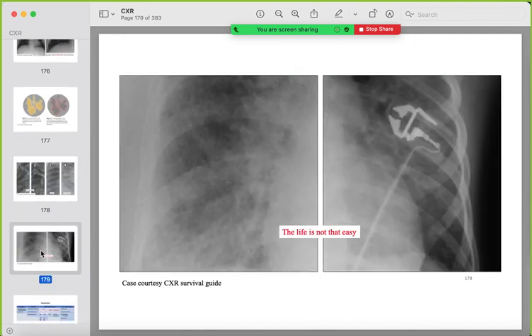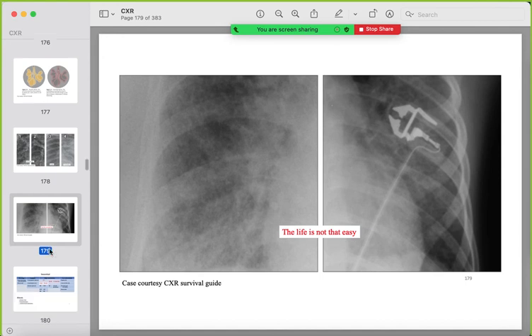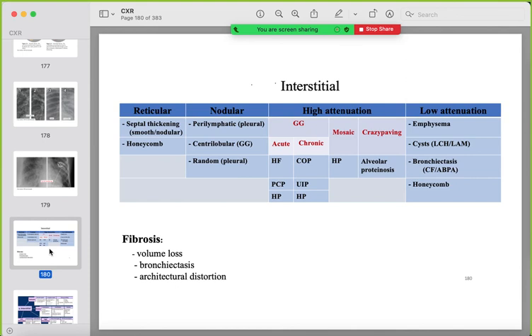Sometimes alveolar and interstitial changes coexist in the same image. On HRCT, interstitial lung disease patterns include reticular (septal thickening, honeycombing), nodular, high attenuation (ground-glass, mosaic, crazy paving), and low attenuation (cystic disease, bronchiectasis). Distribution is key: perilymphatic, centrilobular, or random.